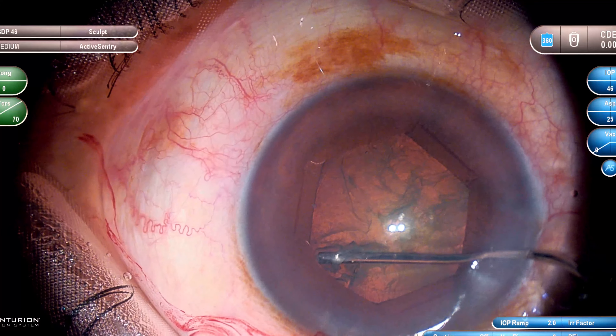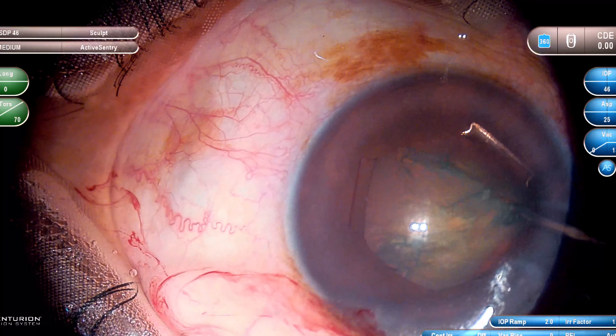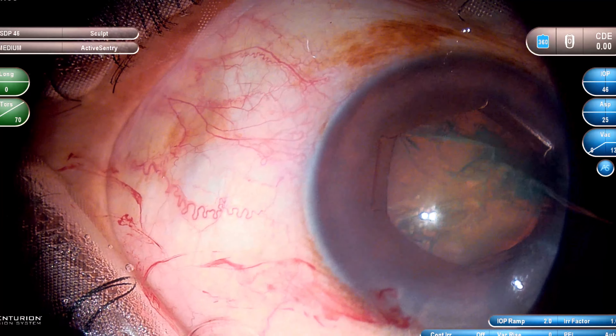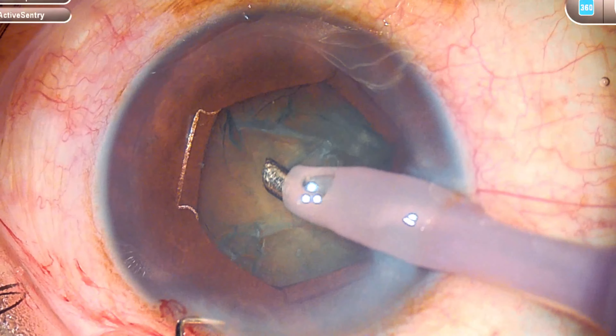It is very important to do a good hydrodissection. You can see that the hydrodissection wave is very nicely done there. And don't push suddenly a lot of fluid in the case of a small pupil, otherwise the iris will prolapse.